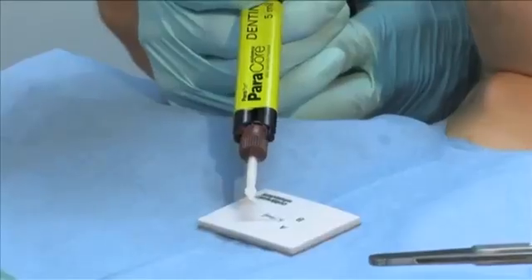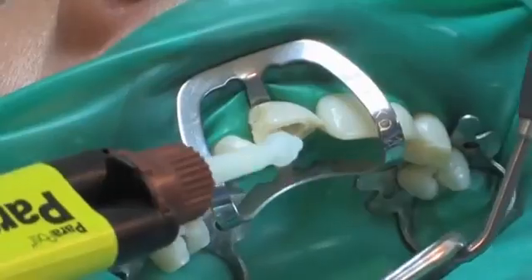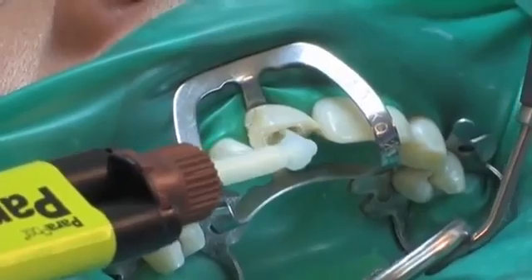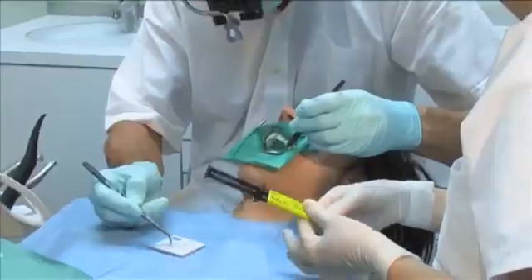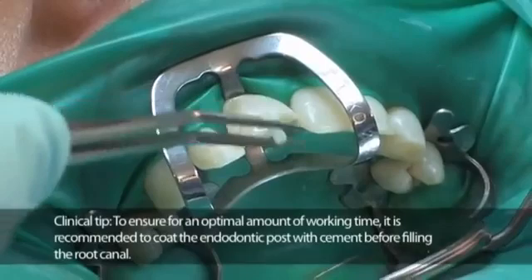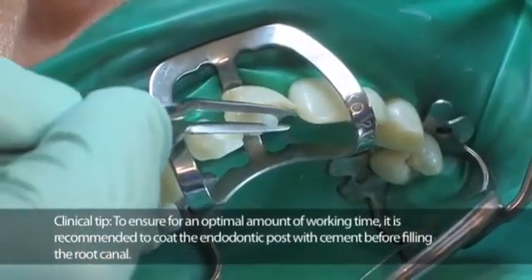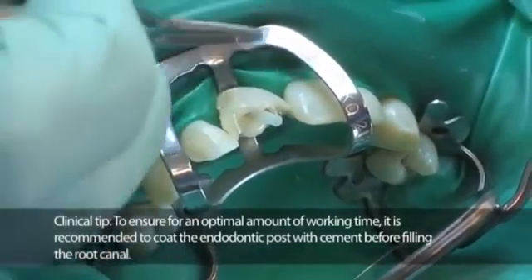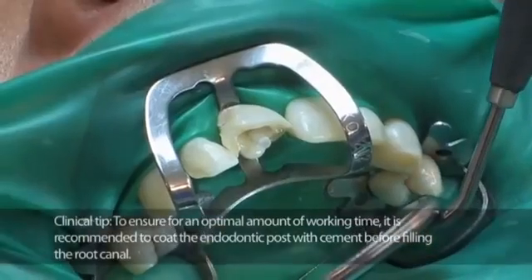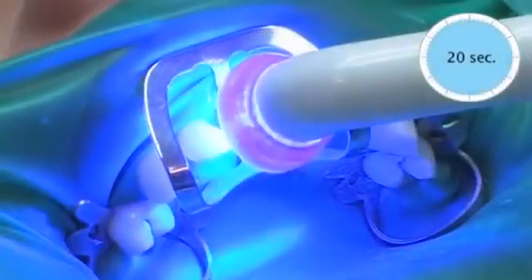The convenient curved root canal mixing tip allows Paracore to be applied directly into the root canal. The untreated post is coated with Paracore and cemented into the root canal. Since Paracore is dual cured, the curing light can be transmitted through the glass fibre post, reaching the Paracore material in the apex to accelerate the curing process.